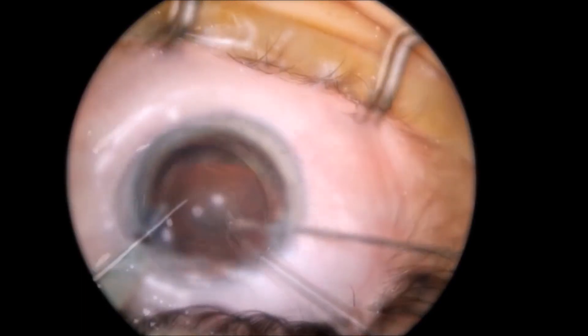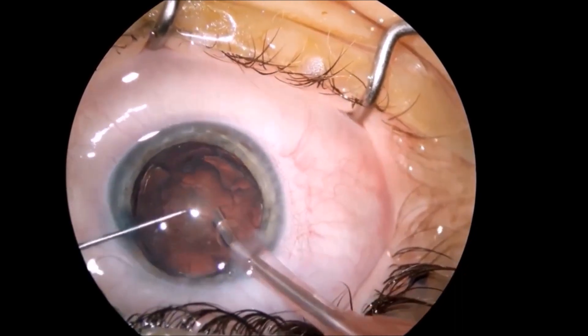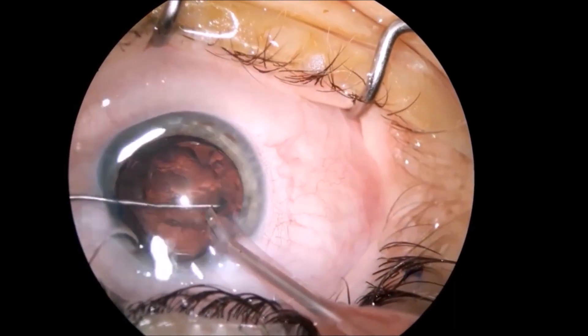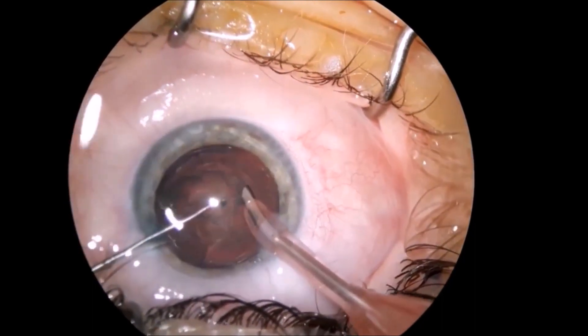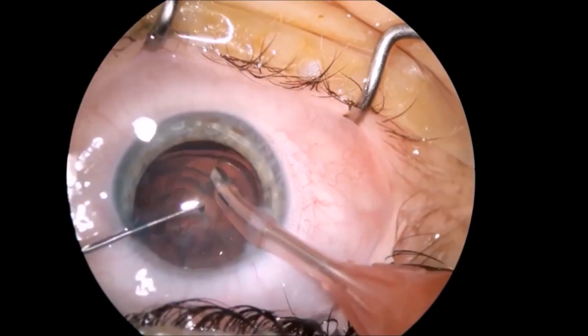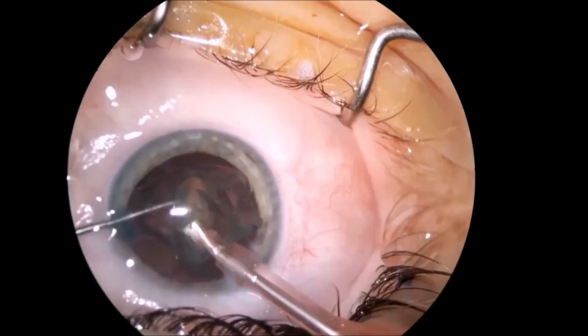hydrodissection has probably lifted the nucleus a little bit out of the bag. I try to do a carousel technique in order to clean the bag and take out the nucleus and the cortex.